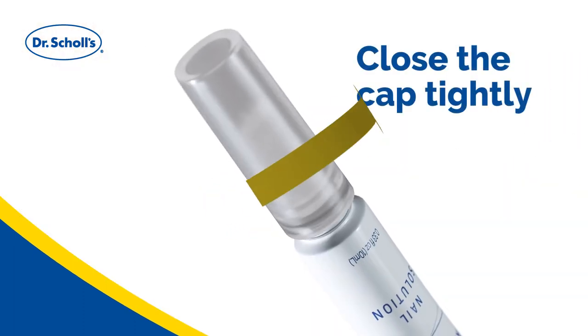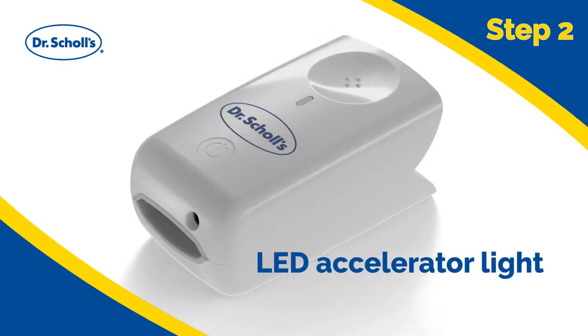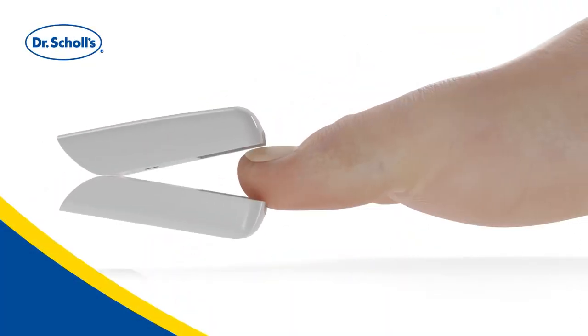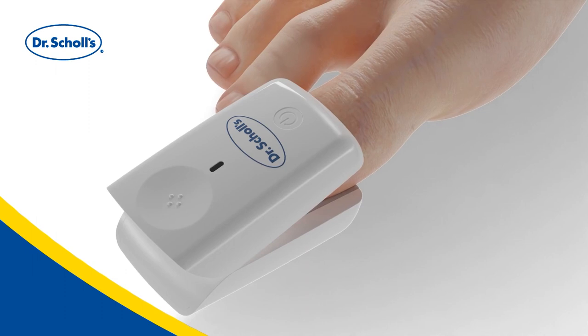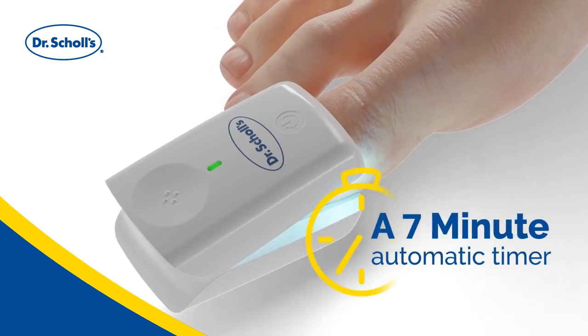Close the cap tightly after application. Next, place the coated nail under the LED accelerator light and press the on button. This device will turn off automatically after seven minutes.